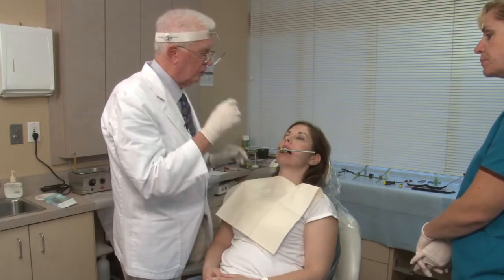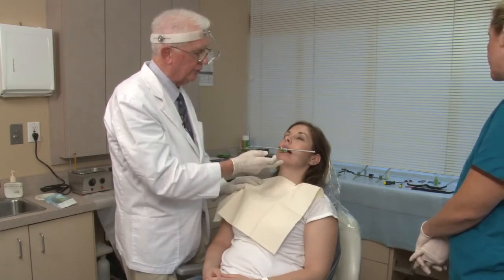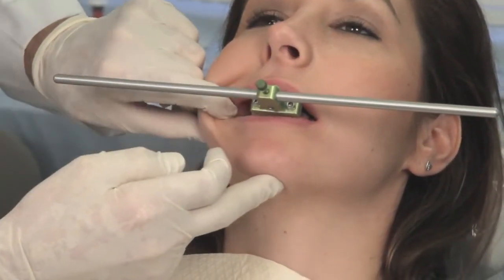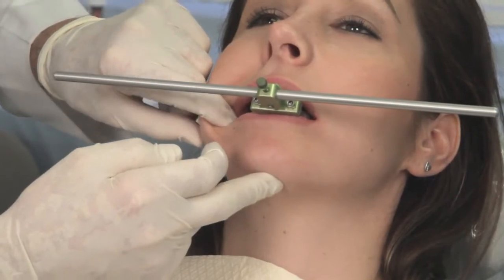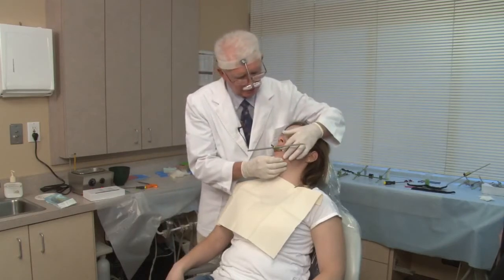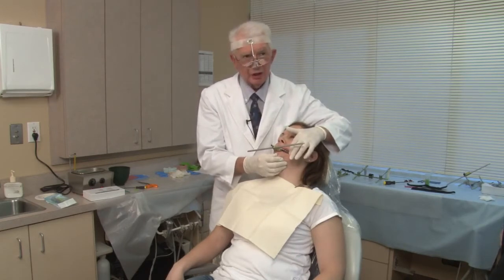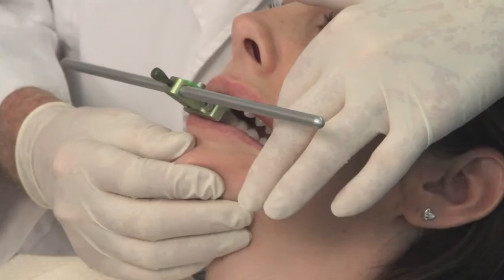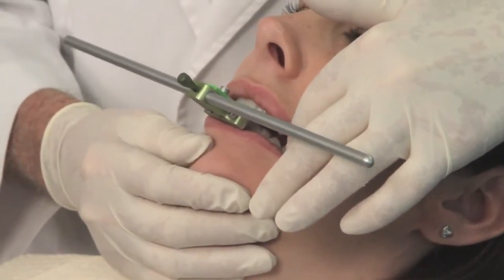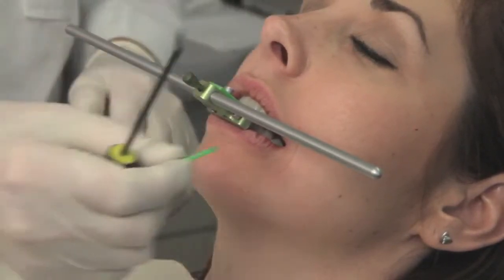Now I'm going to check the disclusion to see if I need more than one discluder. I have the patient close on the anterior discluder, and I look at the posterior section to see how close the teeth are to the splint, or to the clutch. It looks like I'm going to need another discluder. If I can turn the patient a little toward me, and I don't know if you can get this on camera or not, but if you look at the posterior area, you'll see the upper teeth are very close to the lower teeth. That's too close. I'm pretty sure that as the patient starts moving in right and left lateral movements, the posterior teeth are going to hit the clutch. So I'm going to add one more discluder to the anterior segment.